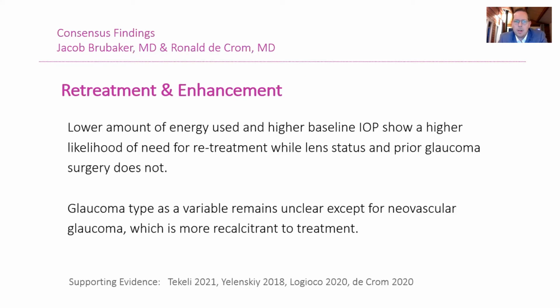Earlier in this webinar, it was already discussed that a lower amount of energy used and a higher baseline intraocular pressure show a higher likelihood of need for retreatment. On the other side, we already know that lens status doesn't affect the likelihood of need for retreatment, and also prior glaucoma surgery does not.